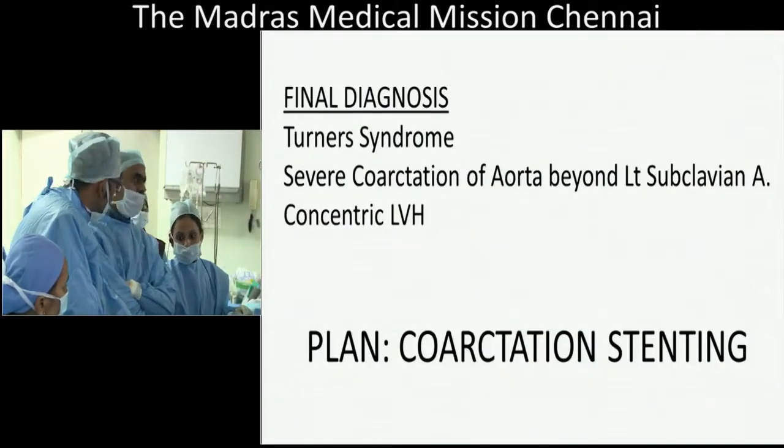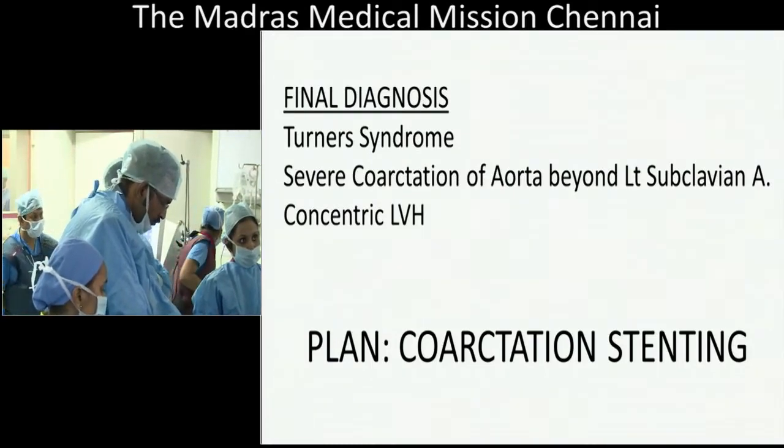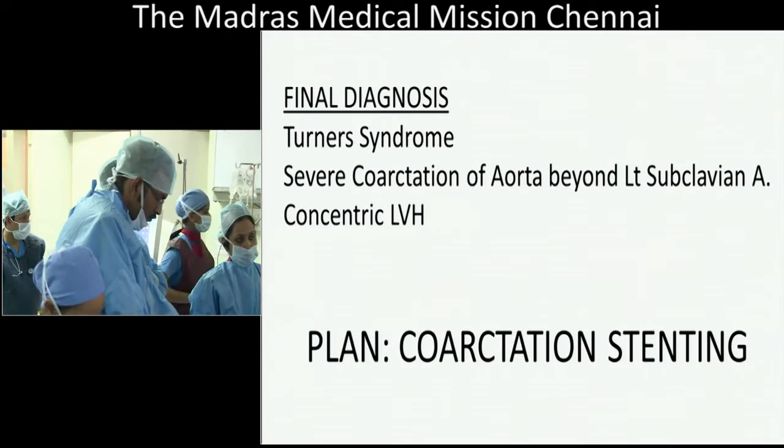So final diagnosis is Turner syndrome, severe coarctation of aorta beyond the left subclavian artery with concentric LVH. Plan is coarctation stenting. Thank you.